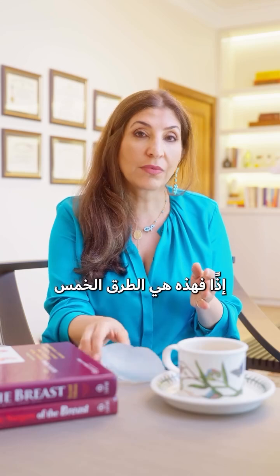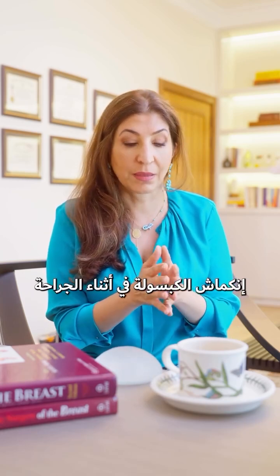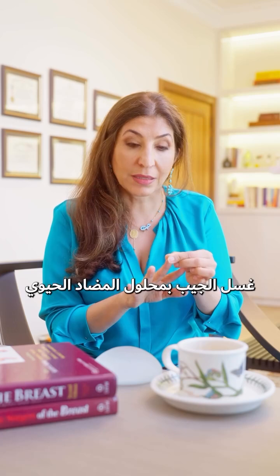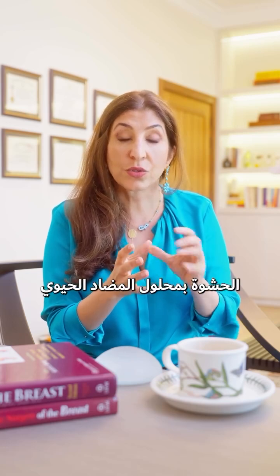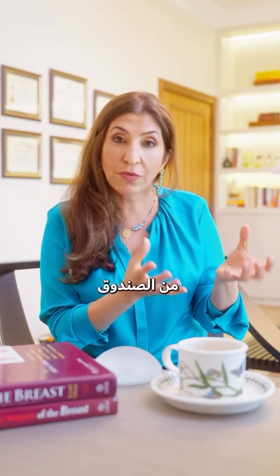So these are the 5 ways that one can prevent capsular contractures at the time of surgery: sterility, covering the nipple, washing the pocket with antibiotic solution, irrigating or coating the implant with antibiotic solution before opening the box, and finally a no-touch technique where the implant goes directly from the box into the funnel and into the pocket.